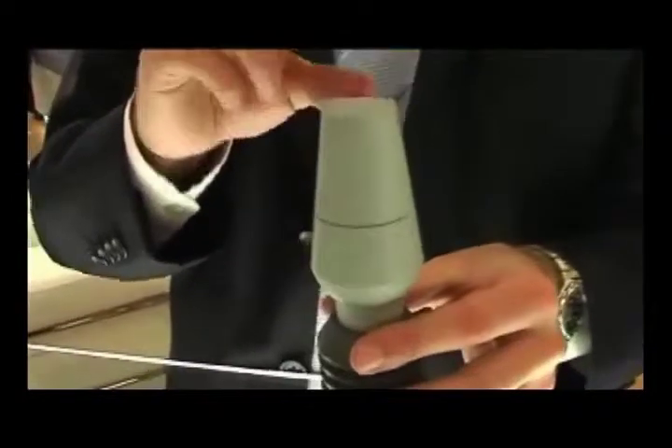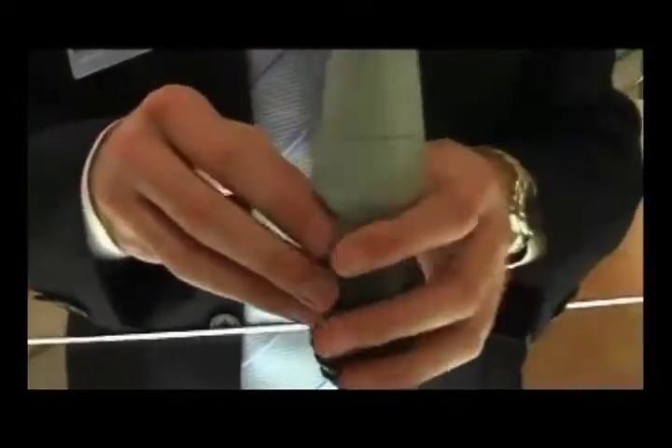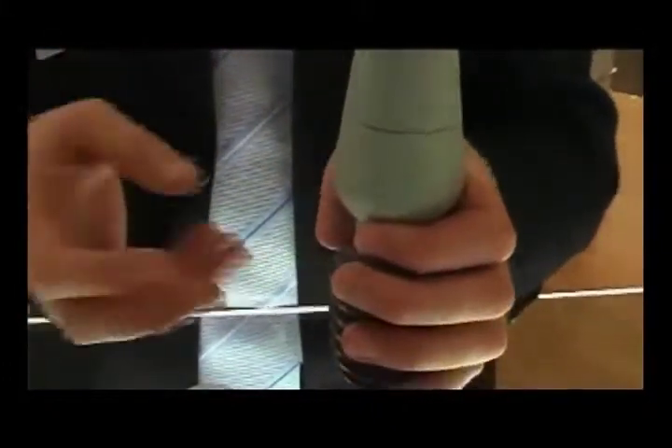The abutment is just simply tapped in. There are no screws — it is a frictional fit. And after that, you just take a simple impression and cement your crown.